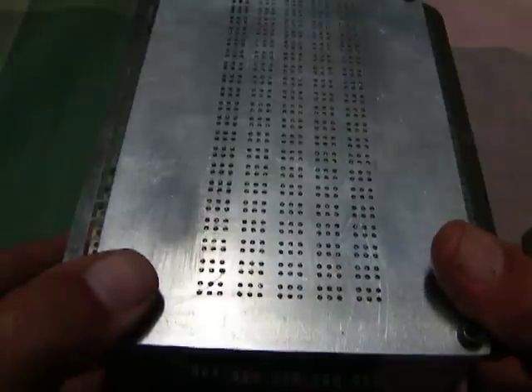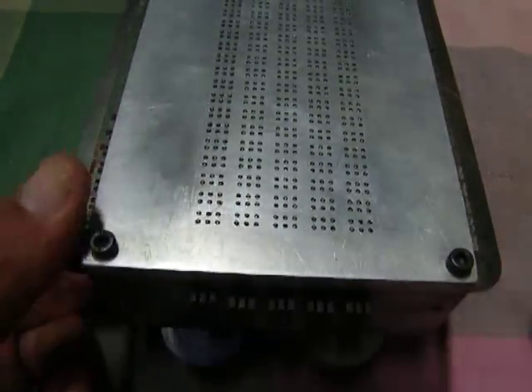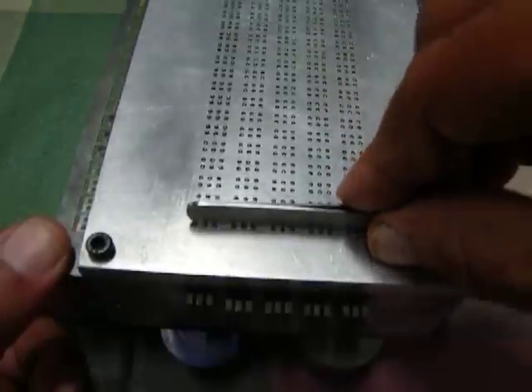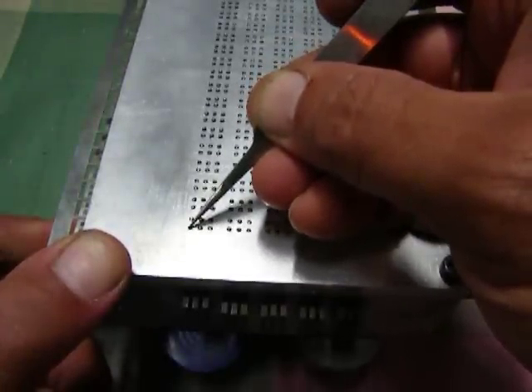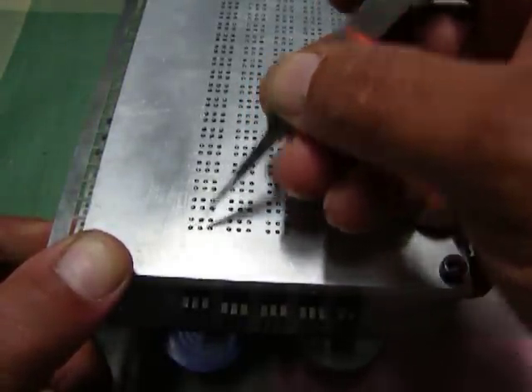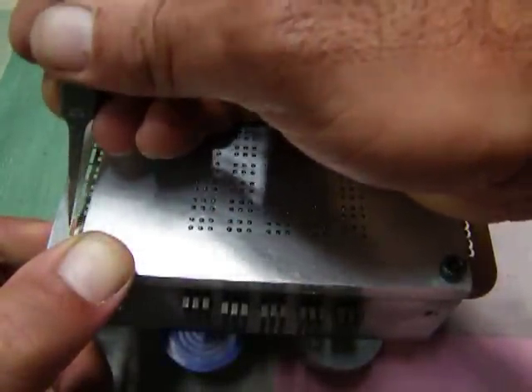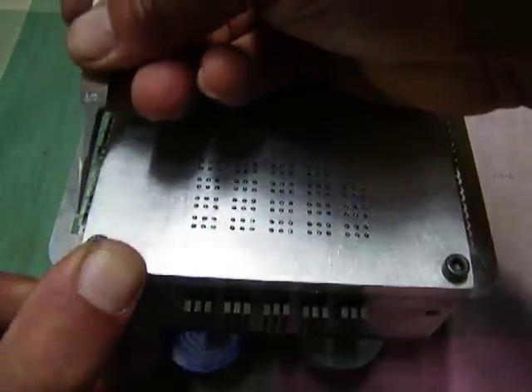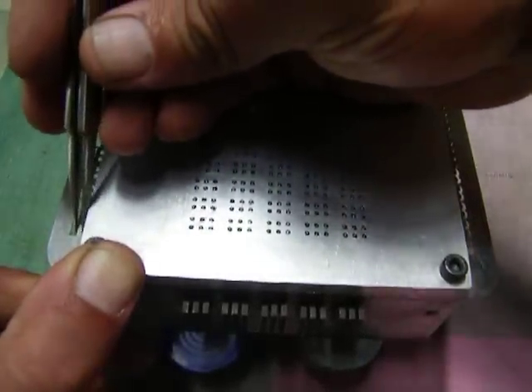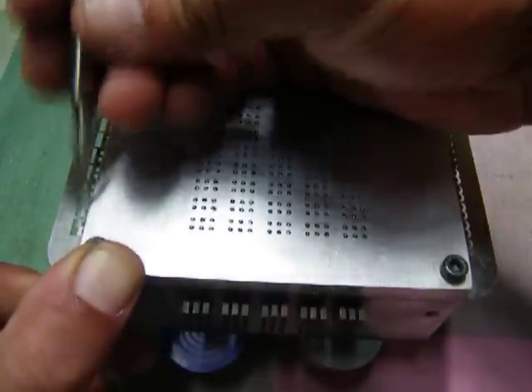Now, what I'm going to do is show you how, suppose you've got to set the data one column at a time. If I want just pin 1 over here to come up and all the rest remain down, what I do is I enable the pin at column 1. So that would basically be, I'm just resetting the row. Enable column 1, that is, I open it. You can see there's a little bit of a gap over here, just that. Now it's closed, open, or latched, open. So now the first one is open.